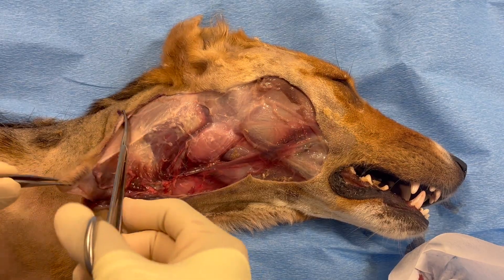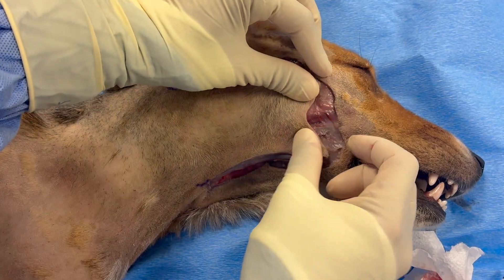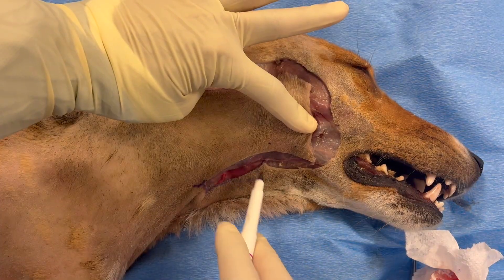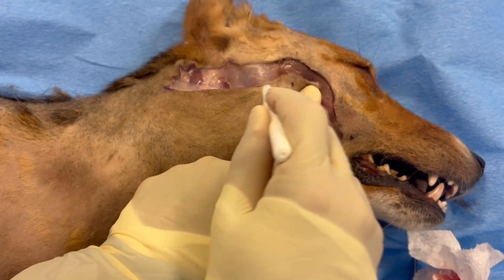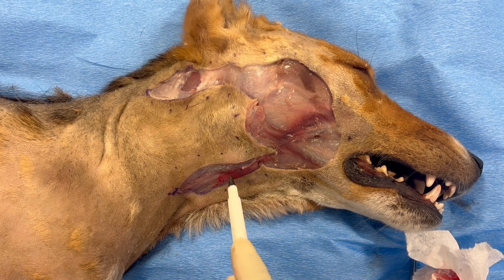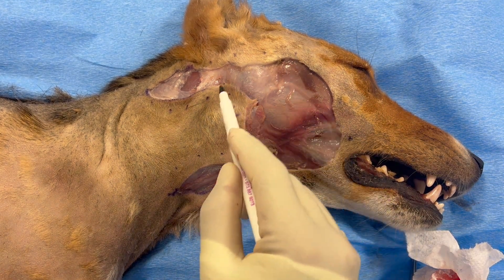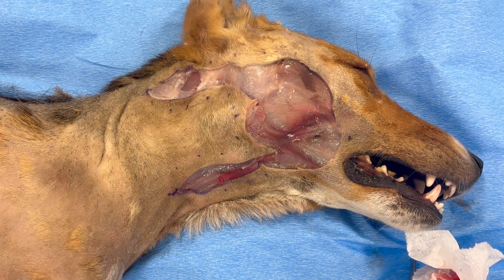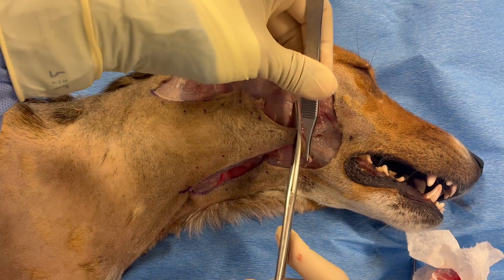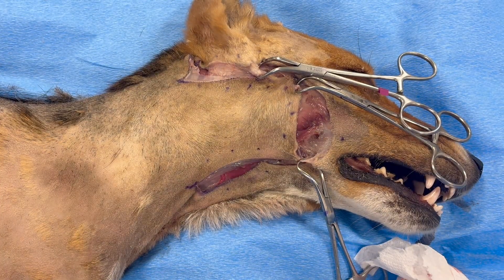A combination of sharp and blunt dissection will be used. Once this has been mobilized, you can see how we can stretch this flap into place. Here I'm placing some corresponding marks to demonstrate how we are going to advance this flap, and therefore there will be tension along the proximal or dorsal and ventral aspects of this closure site, thereby distributing the tension away cranially.